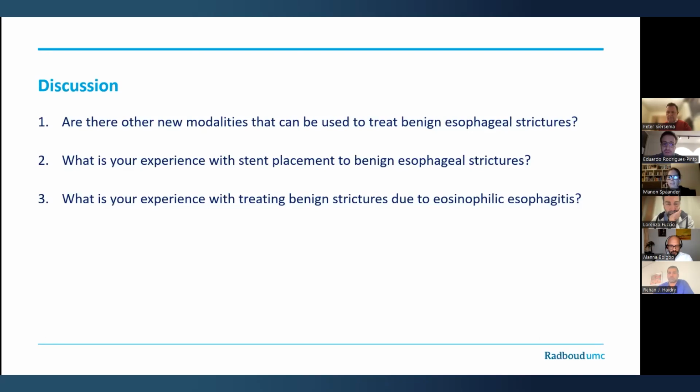And we know from the literature that the risk of adverse events is not higher than in the other etiologies. Some patients may report more pain after dilation. However, the risk of perforation is not higher if the technique is done properly. So usually I dilate them with balloons instead of bougies, and I do it gradually, increasing the balloons in some sessions, and I try to optimize medication.